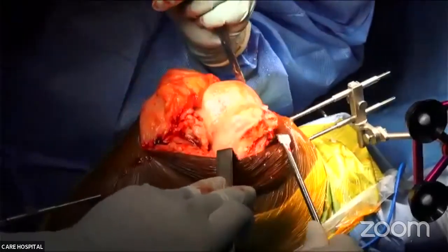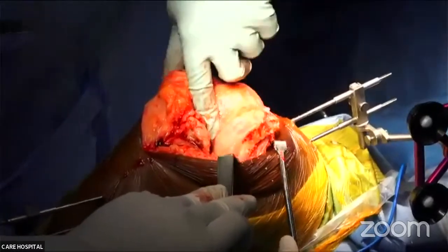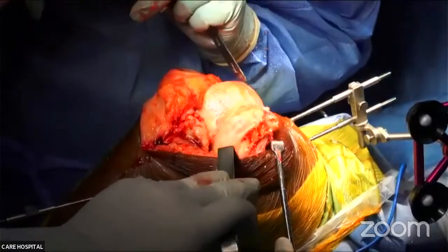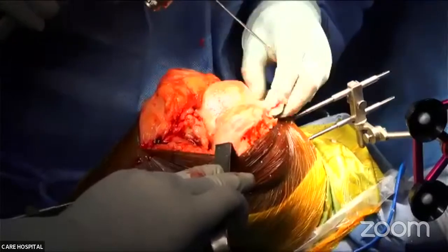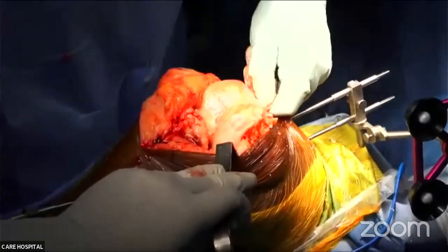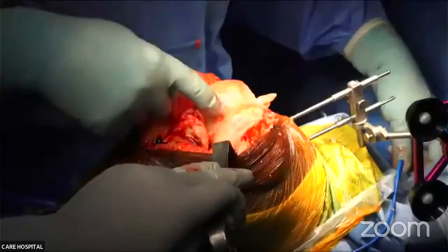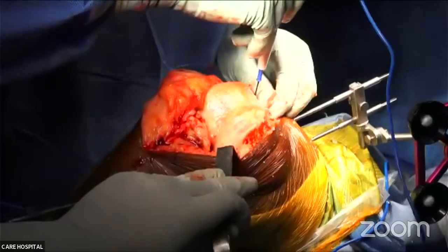And what about the meniscus and ACL? Yes, ligaments, PCL, especially PCL, but meniscus is not necessary. So meniscus can be kept. And do you remove the PCL before the bone cuts or later? I just cut it from the femoral aspect.